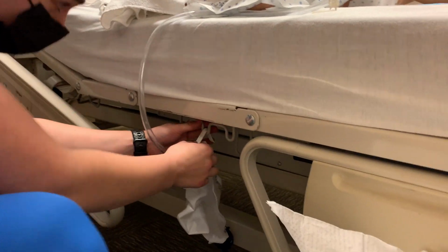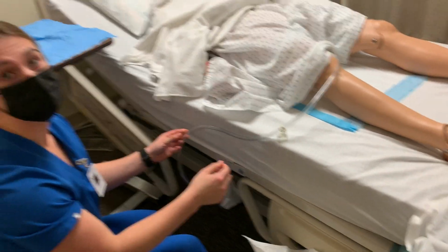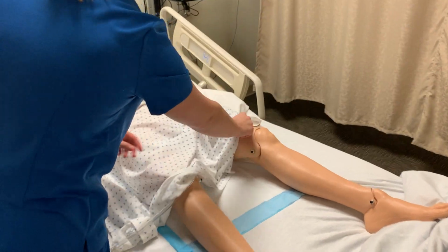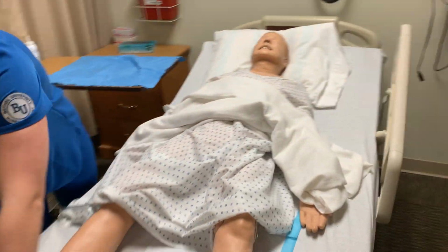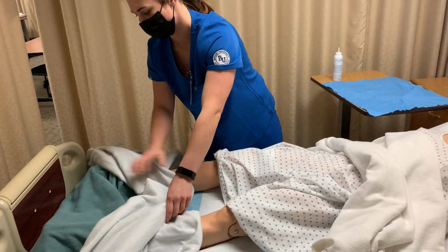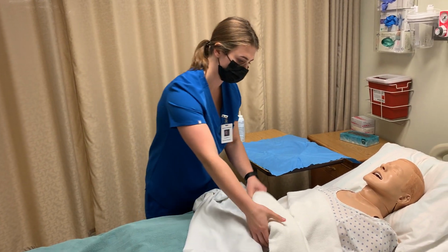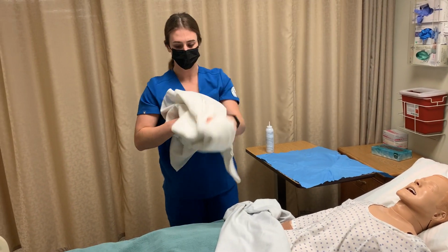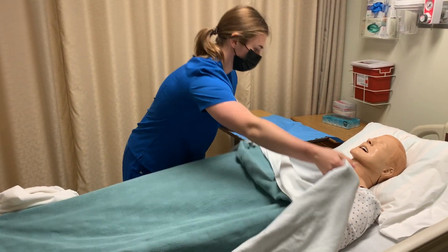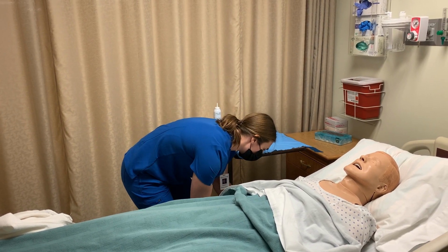I'm going to go ahead and attach it down here where it's not going to move with any of the side rails. I'm also making sure that there's no kinks in the tubing, and that it's not going to catch on anything. Okay, how are you feeling, Alexa? I'm feeling good. I can barely feel it. Okay, good. If you notice any discomfort, you can go ahead and let any of your nurses know. And we can always make sure that everything's still in place. Okay.